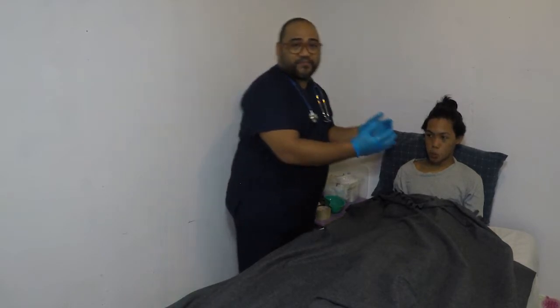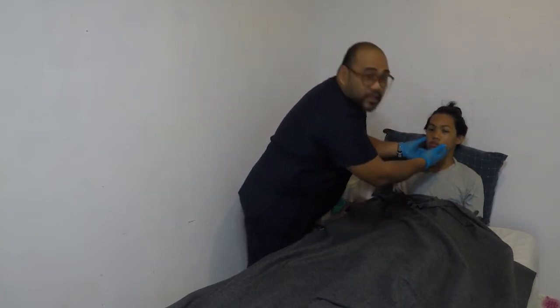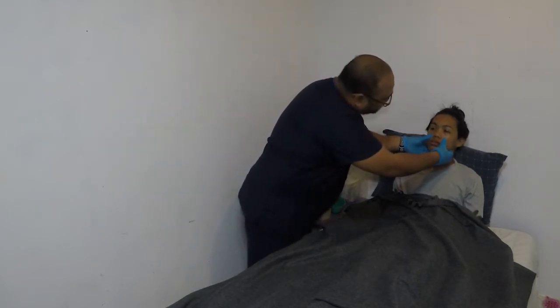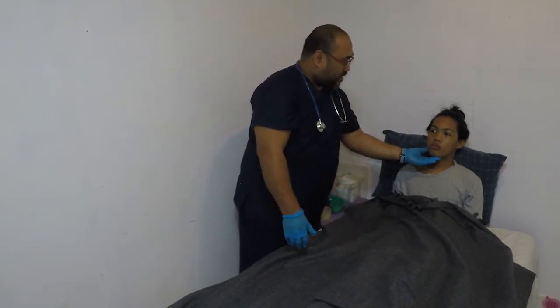Then check the nostrils. The tube passes more easily through the nostril with the largest opening. So we have to check by checking the nares for patency, by asking the client to occlude one nostril and breathe normally through the other. So have to check, sir. Inhale on your nose. Exhale. Inhale.